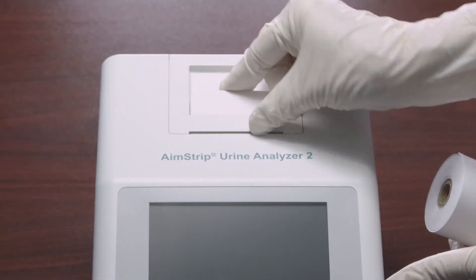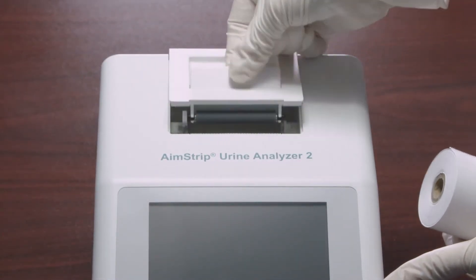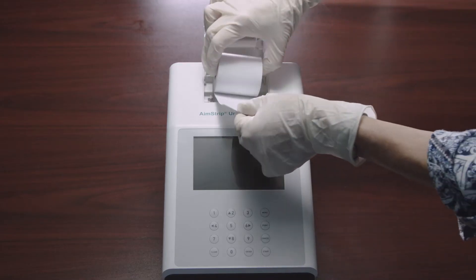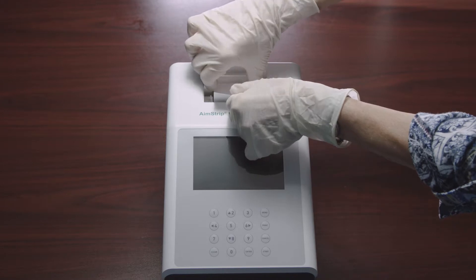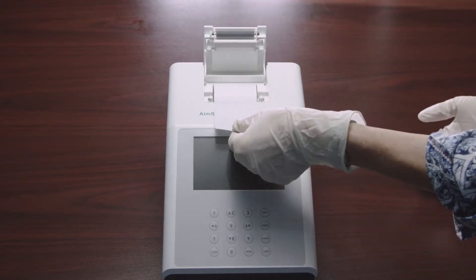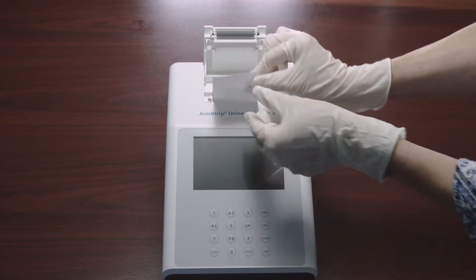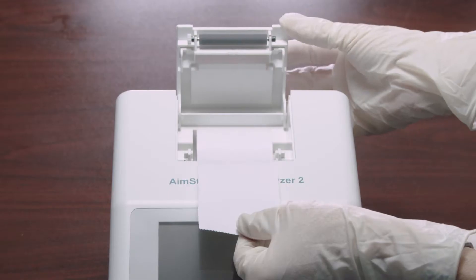To load the printer paper into the internal printer, open the printer cover by pulling up on the tab. Place the new paper roll into the printer paper compartment with the paper unrolling from underneath and towards the compartment wall. Pull about 4 inches or 10 centimeters of paper past the top edge of the paper compartment.